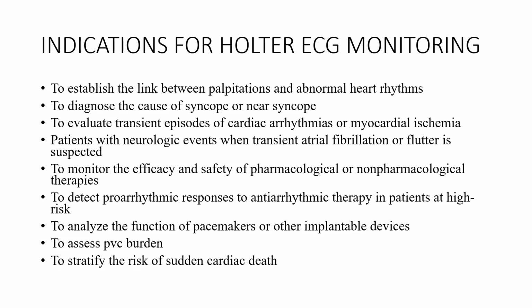For example, a patient with hypertrophic cardiomyopathy who does a Holter and you see a non-sustained VT. That's a marker for sudden cardiac death, and the patient will benefit from device therapy.